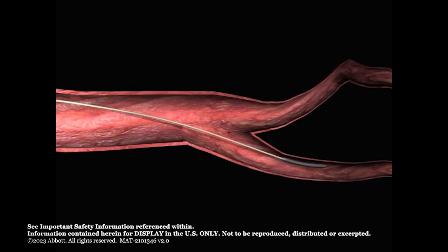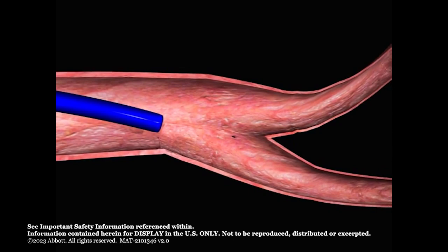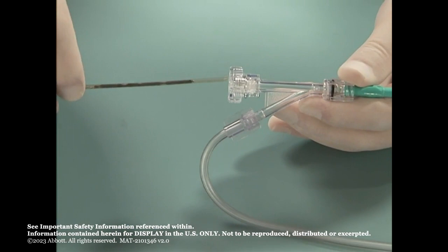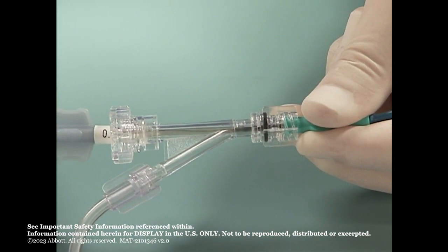Advance the selected delivery sheath or guide catheter over the guide wire to place the distal tip at the distal edge of the occlusion site. Remove the guide wire. Open the hemostasis valve or Y connector on the delivery system and insert the loading device into the valve. Advance the delivery wire to move the plug into the delivery system.